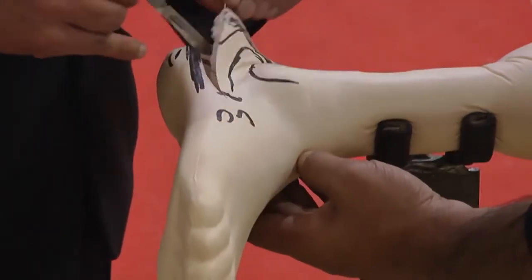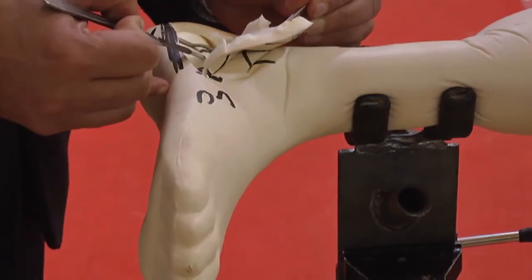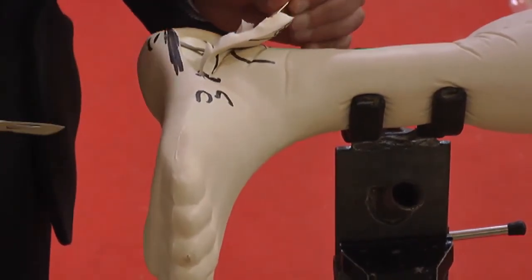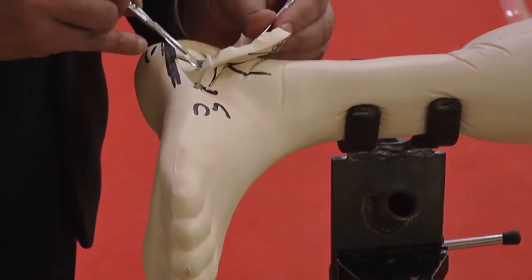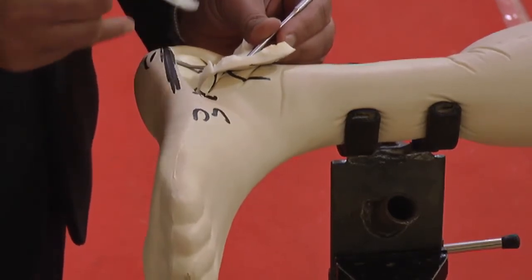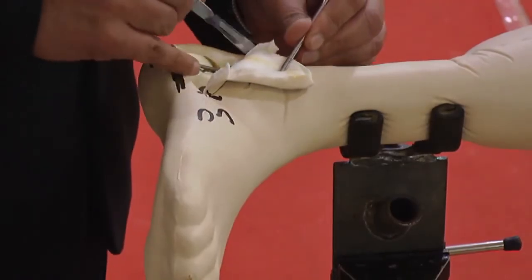You continue this dissection without holding the flap at all, unless you reach this area here, which is the peroneal tubercle, but you'll not be seeing the peroneal tubercle, obviously. Here you will be seeing a shiny tendon coming into view, that is the peroneal tendon. And your dissection then continues below the peroneal tendons, and your retractor comes into play, and the peroneal tendon is retracted. As you retract the peroneal tendon, the deeper part of the peroneal sheath is continuous with the calcaneofibular ligament, so you will dissect that off the bone, and with that, the tendons will be retracted with the flap.